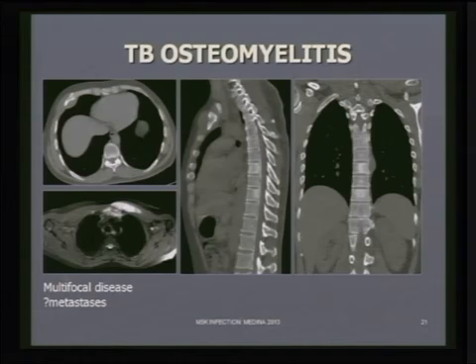This is a young lady presenting to the sarcoma service with 2 masses on her chest wall. So here we have one seen on the CT study on the right side of the inferior chest wall related to the rib, and the second on the left side of the upper chest wall related to the sternum, with extension into the pectoralis major muscle here.